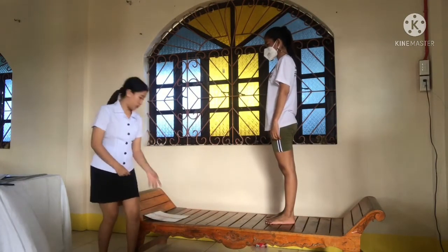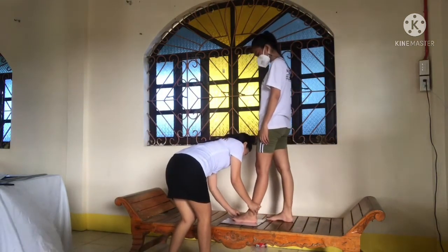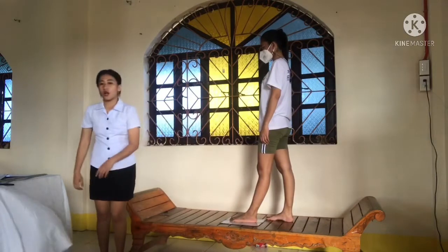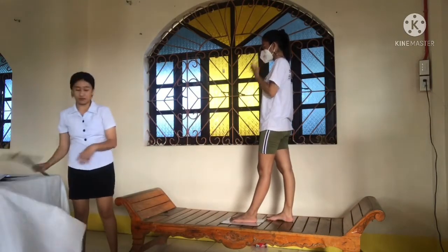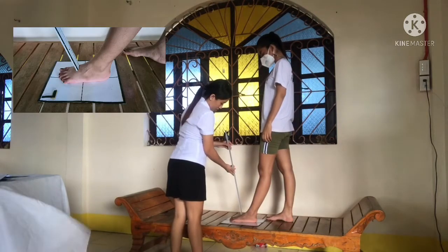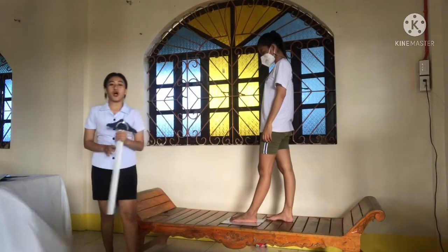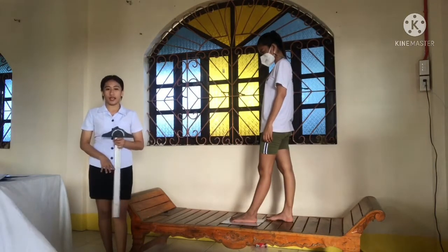Adjust the IR under the foot and center its midline to the long axis of the foot. So, direct the central ray at the base of the third metatarsal. So, this shows a full outline of the foot is projected free of the leg.